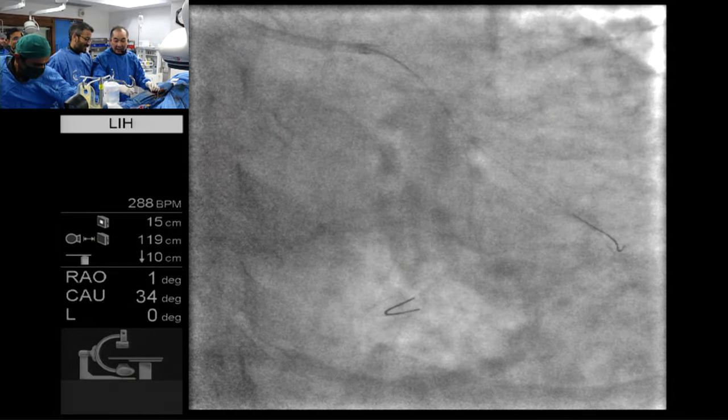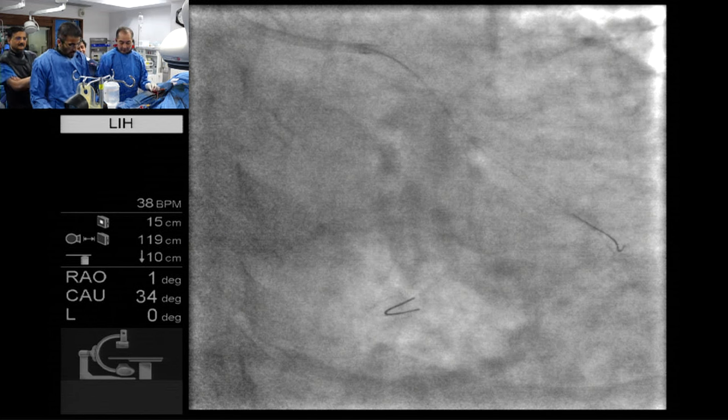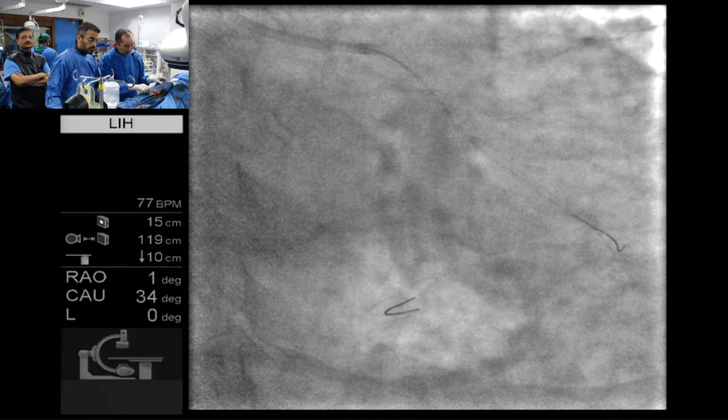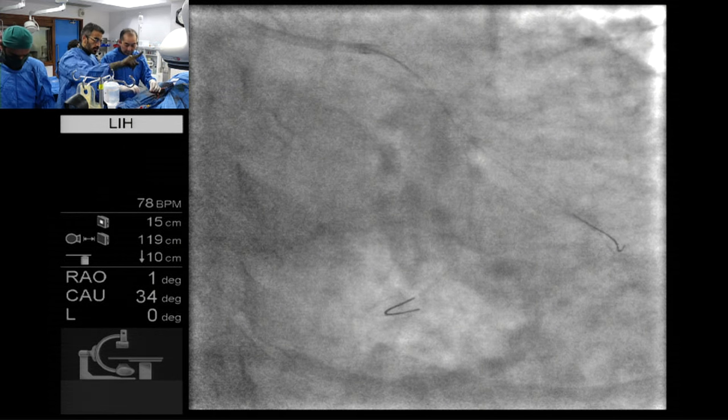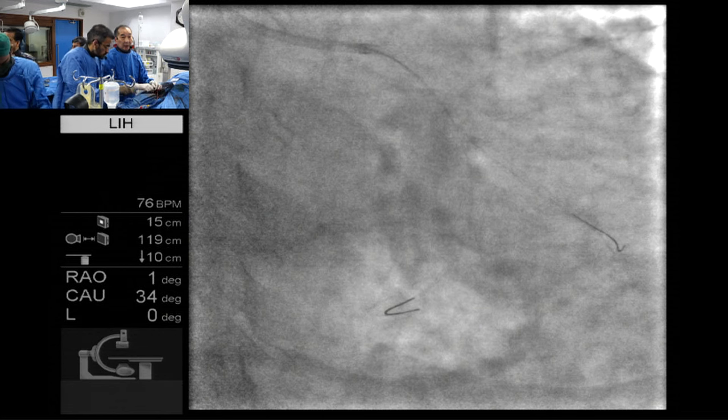All right, let me see if I can get a 2.5 balloon down. Virtually completed. If not, I will get a 1.0 balloon. Okay, can I have the 2.5 balloon? Yes. Oh, shit, this is... 2.5 balloon, inside branch. Yeah, Pilot 50 is a very good wire. And how does that distal OM look? Can we take a look? With the nitro and all that?